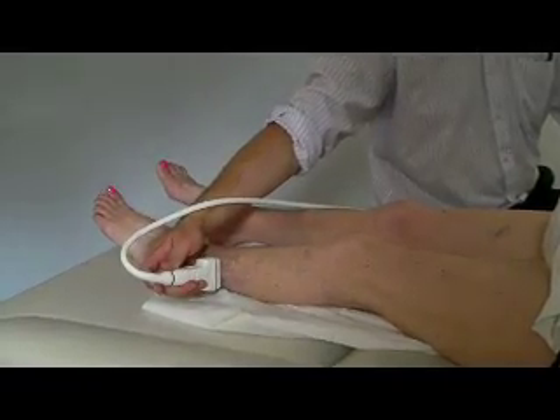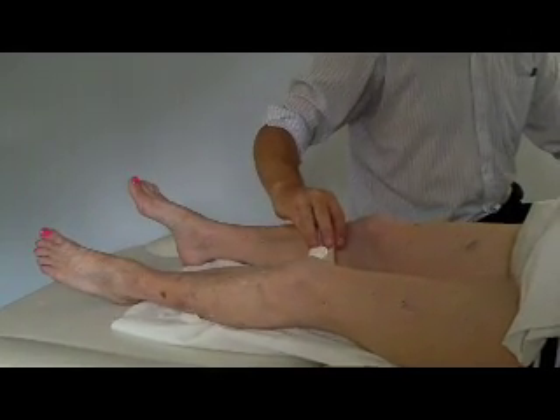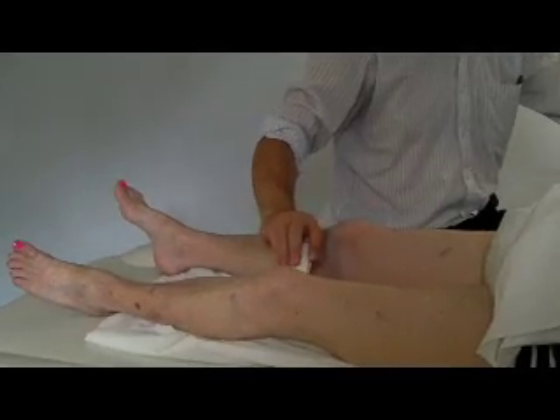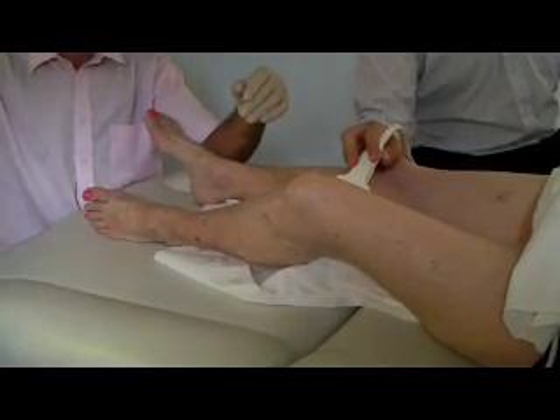This video explains the process of having the treatment called Foam Sclerotherapy, sometimes called Varica Foam. It's the treatment that's used by the vein care surgeons. The first part of the treatment is to have a venous duplex scan. This allows the doctor to find out which veins need to be treated.